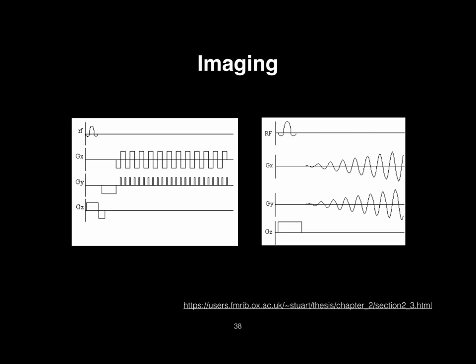With MR, because you're imaging essentially the bulk effects of things, you're imaging at the macroscopic level things from essentially the microscopic, subatomic level. How you play gradients, and even if you have the same things, if you just time them differently, you can really get differences in contrast and how the tissue looks in the image that you end up with. And that's really one of the nice things about MR.